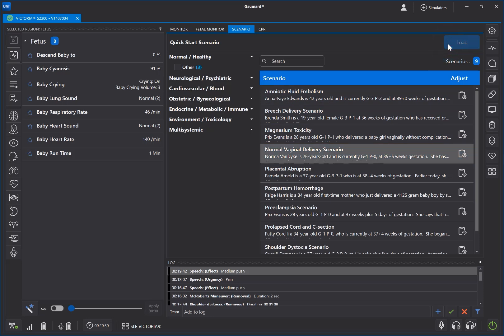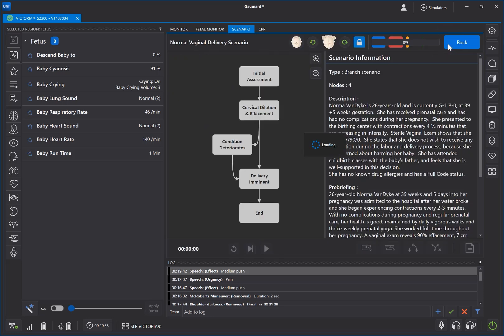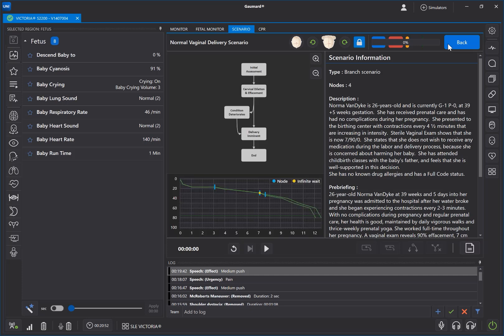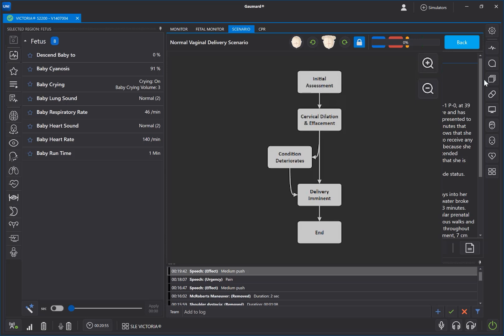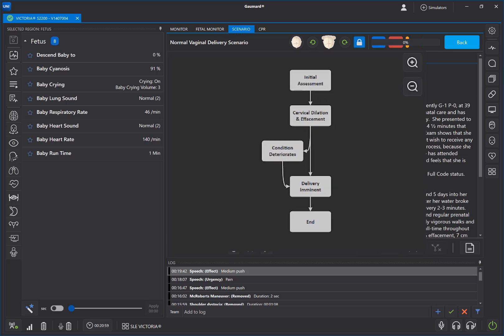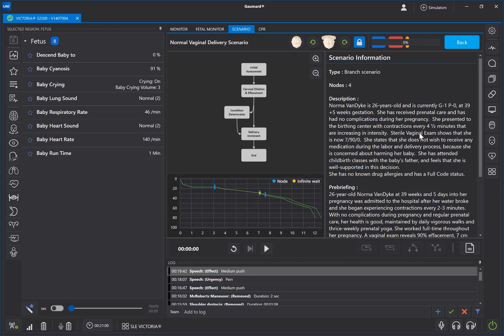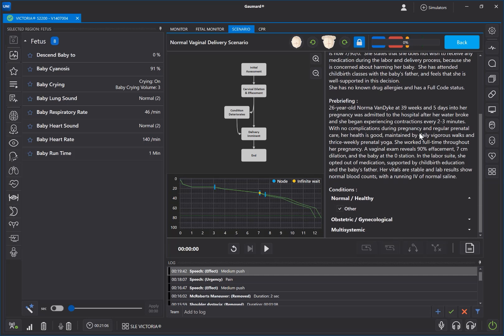Make sure you have the birthing fetus connected to the birthing simulator before starting a birthing scenario. The Scenario tab houses all the controls and sensors needed to follow along a pre-programmed scenario. The scenario map shows the different nodes, pathways, and events available during the scenario. Initially, the details pane shows the type of scenario, number of nodes, the description, and any pre-briefing to go over before the scenario starts.